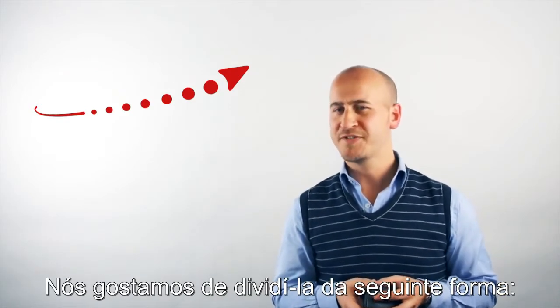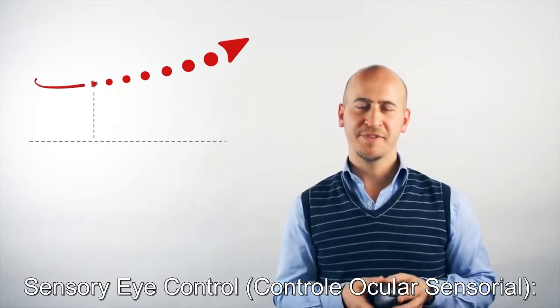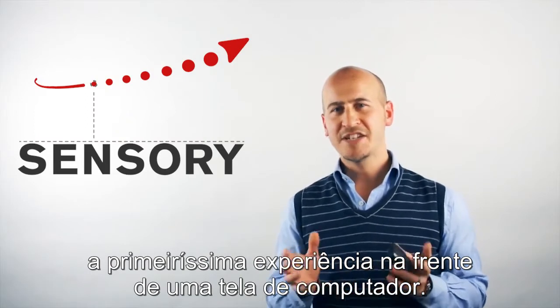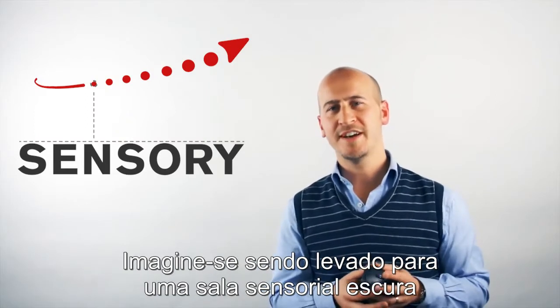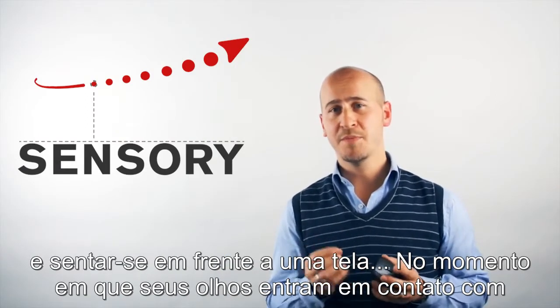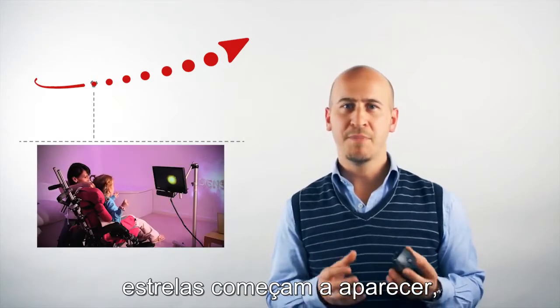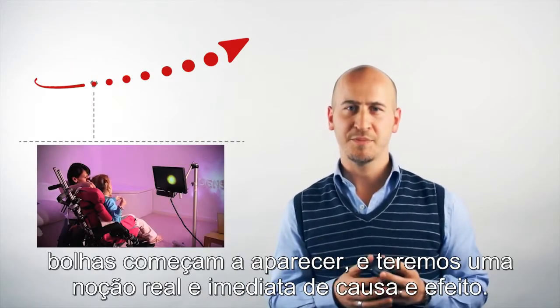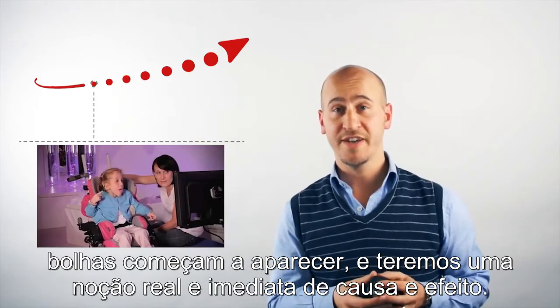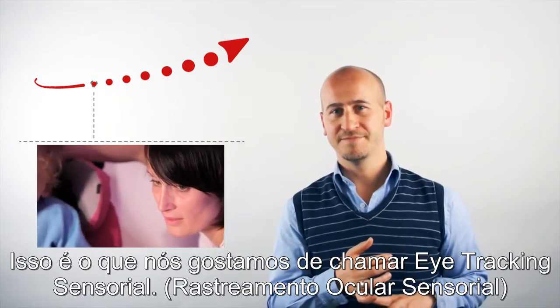We like to break it down as follows. Sensory eye control: the very first experiences in front of a computer screen. Imagine being taken into a darkened sensory room where we sit in front of a screen and the moment our eyes make contact with that screen, stars start to appear, bubbles will start to appear. We'll get a real immediate sense of cause and effect. That's what we like to call sensory eye tracking.